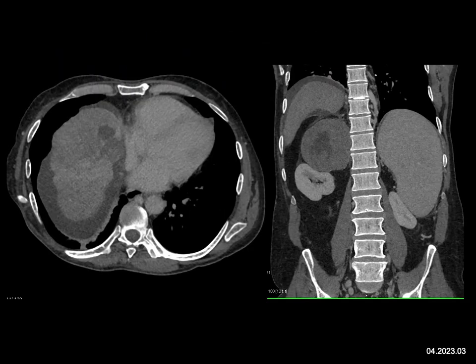The most likely diagnosis of the right adrenal mass — on the coronal view we see about a five or six centimeter adrenal mass, solid with central necrosis. The differential includes primary adrenal cortical carcinoma; pheos are less likely because there's no vascularity. Then looking at the liver, it's cirrhotic with ascites and a mass in the right lobe, and the spleen is enlarged — findings highly concerning for hepatoma.